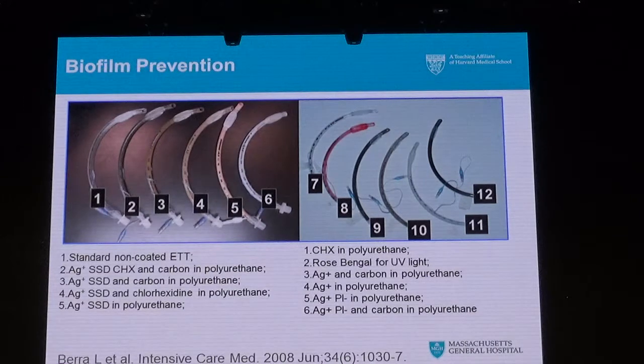So in order to decrease bacterial colonies, what we did was use a combination of antiseptics and also bacteriostatic agents to coat the internal lumen of the endotracheal tube.